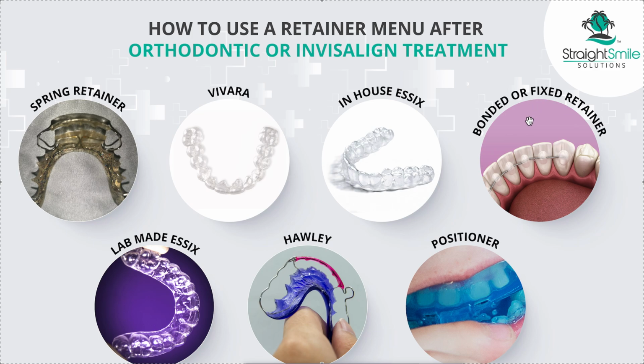This is our bonded or permanent retainer, and I've got a ton of content on that. Again, you can go listen to all the content on different customizations. Should it be just 2 mesh pads in the end? Should you use just a braided wire? Should you have it custom made? Should you make it yourself? Should you put a mesh pad on all 6 teeth? Personal choice.